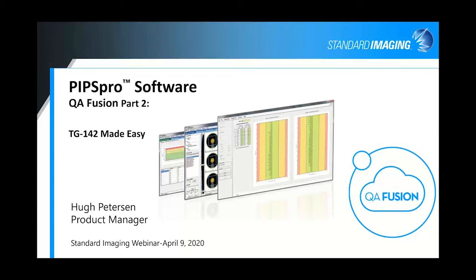You'll see on the screen we say QA Fusion Part 2. We actually have a new merged product called QA Fusion, which is the PIPSpro component, which I'll show you today, and our QA Pilot component, which is our QA database management software. And we have various webinars on that as well.